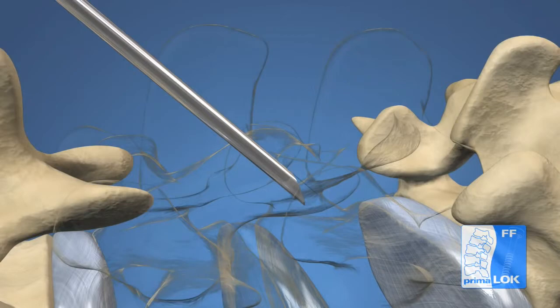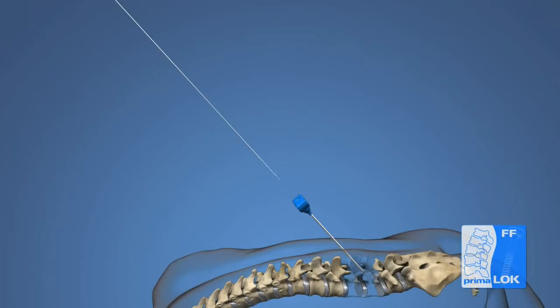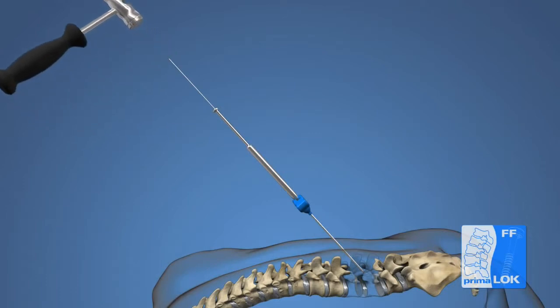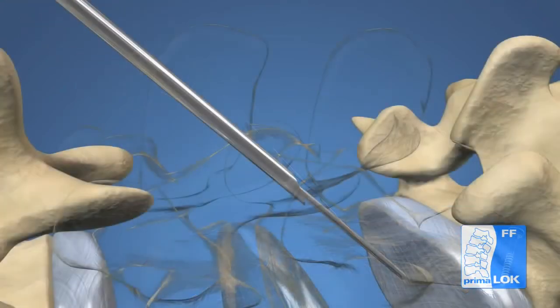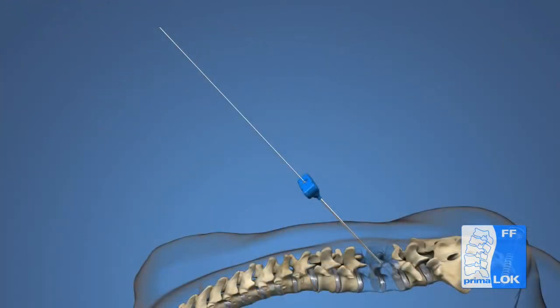The access needle can be carefully advanced through the superior facet and into the inferior facet, or the inner obturator of the access needle can be removed and guide wire inserted. This will be dependent upon quality of bone and surgeon preference. The guide wire can be driven manually or under the assistance of a power wire driver. Drive the guide wire across the facet joint and through the center of the pedicle into the posterior third of the inferior vertebral body. The wire stiffener placed over the wire at the proximal end of the access needle will help prevent wire bending.